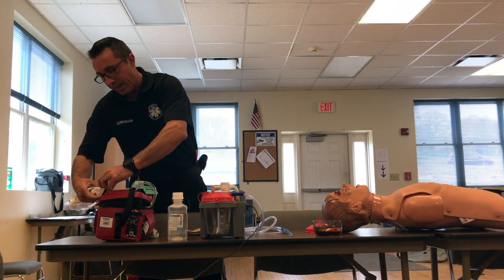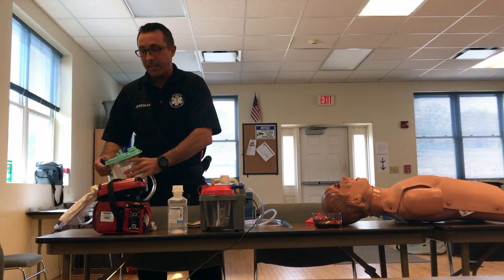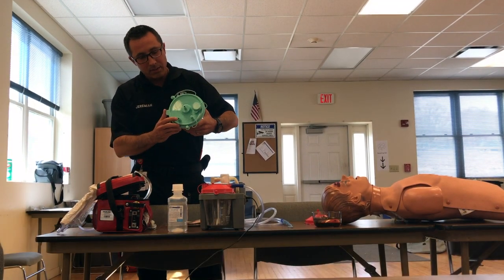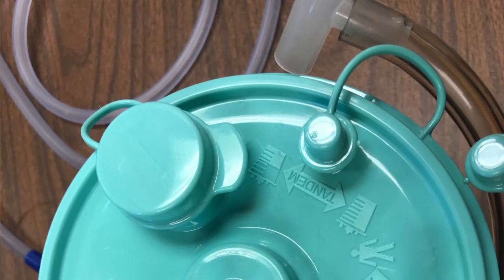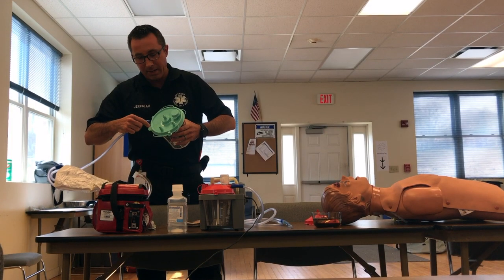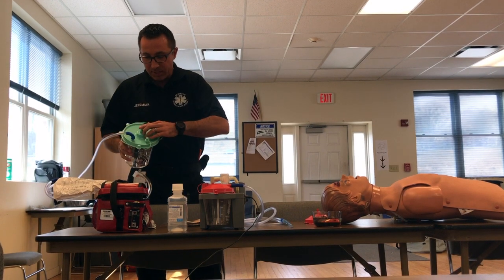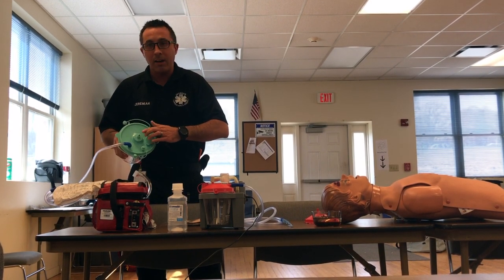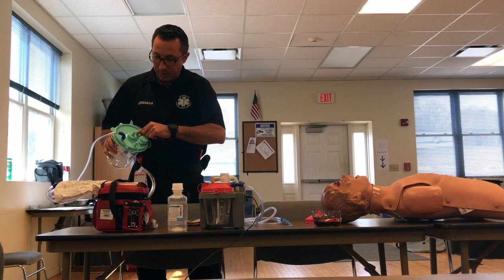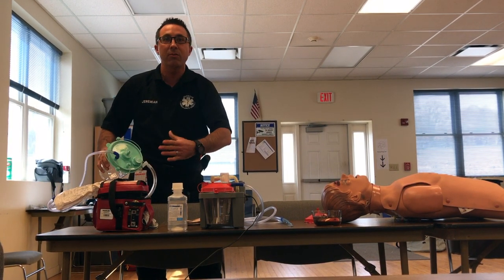You'll see that there's tubing attached to it, and the other end is going to go on your suction canister. These are portable, so if you fill it up, you throw it away. There's a barb fitting that says 'patient' — so the suction tubing attaches to the patient side, because this is the tubing going into the patient's mouth. There's a center hole that says 'vacuum,' and that hole connects to the tubing attached to the suction machine — that's where the vacuum is created.